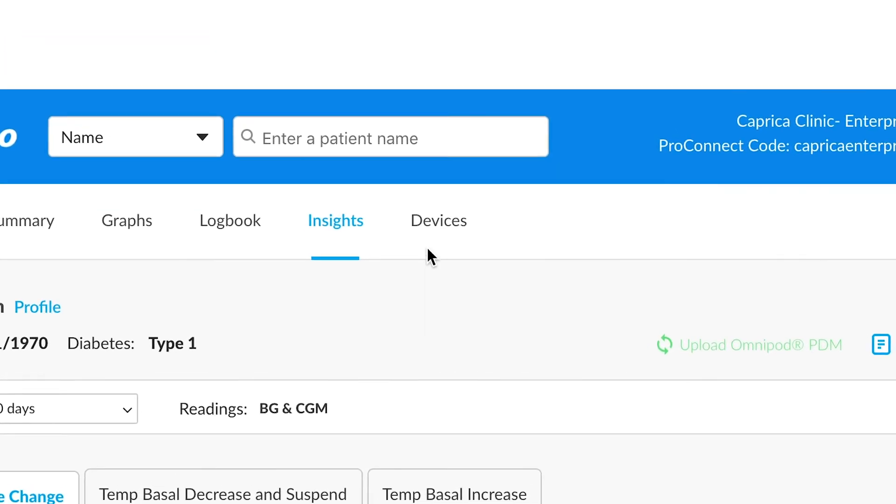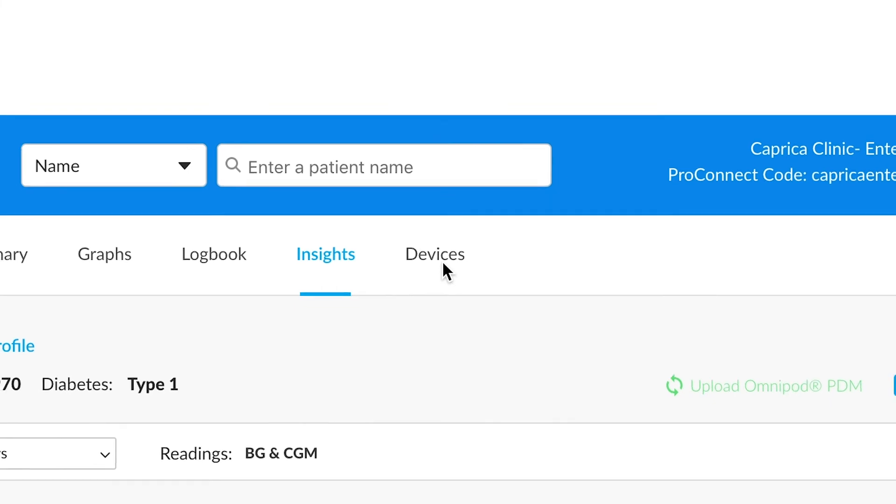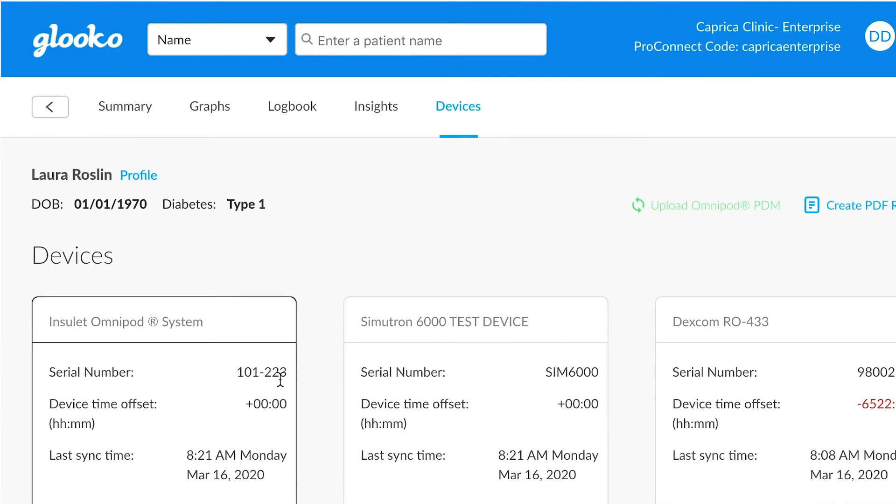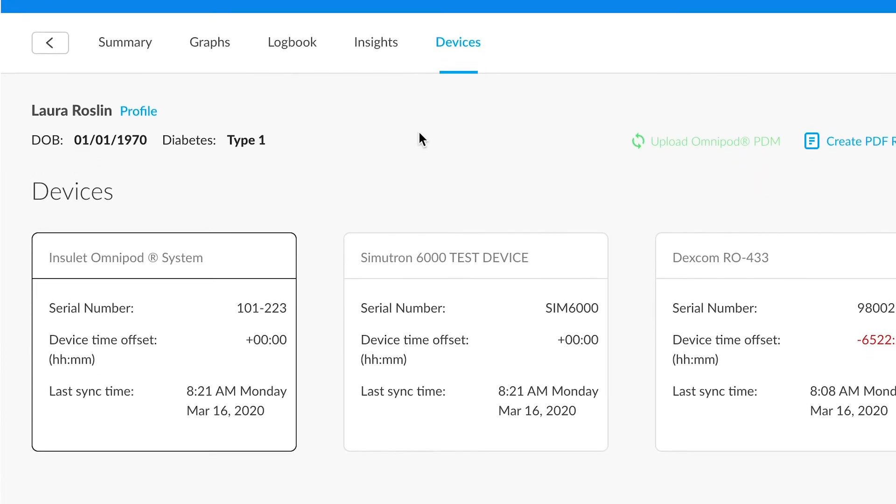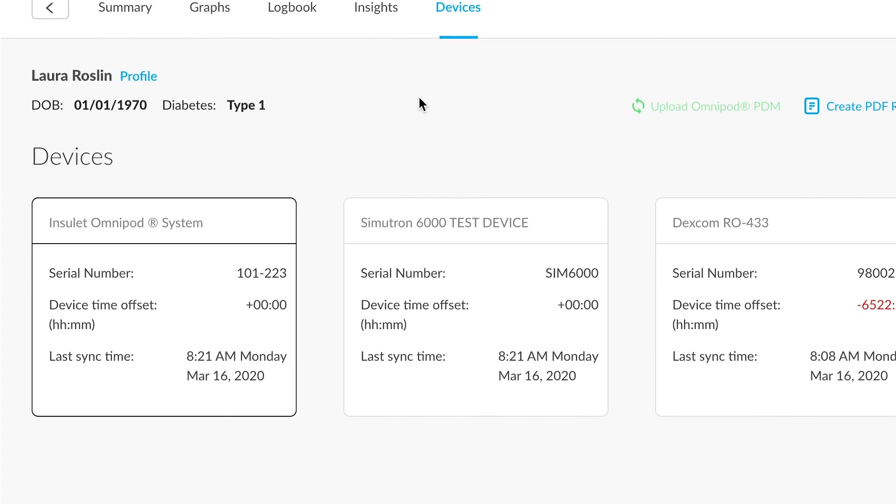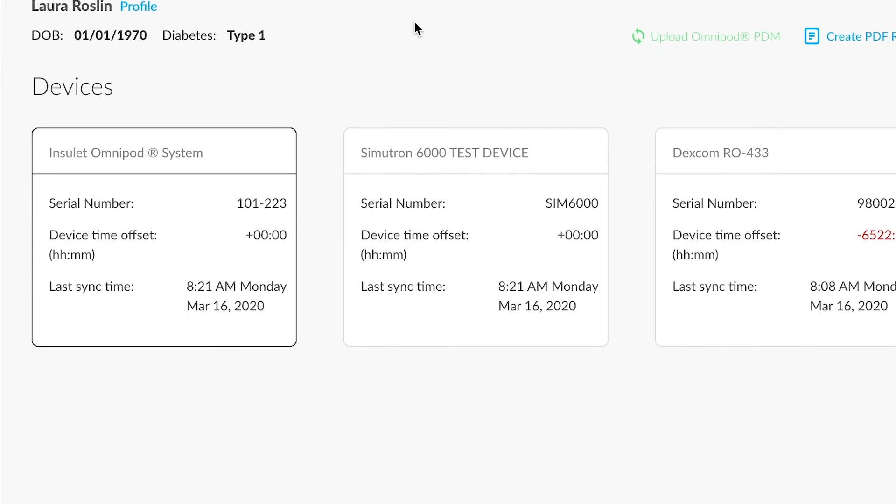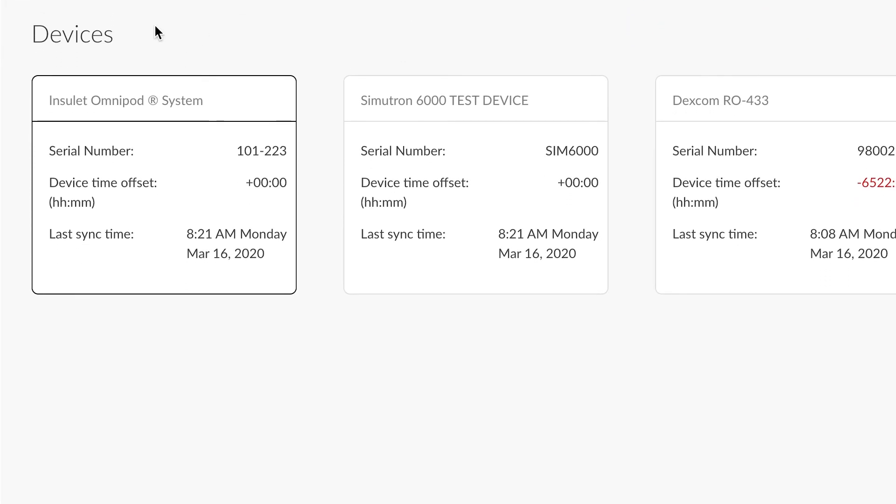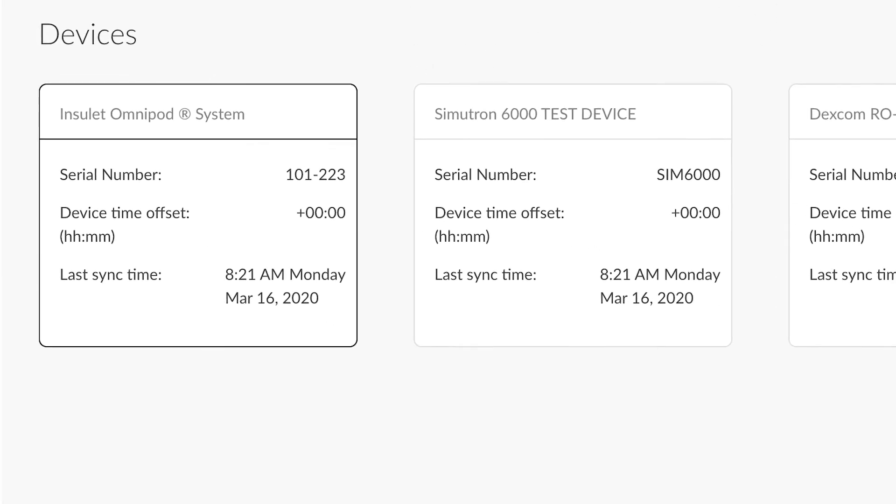Last but not least, another handy feature is this devices section. Devices allows you to understand what devices have been uploaded to a patient account. For this specific patient, you'll see there's been an Omnipod, Simutron 6000, and a Dexcom.